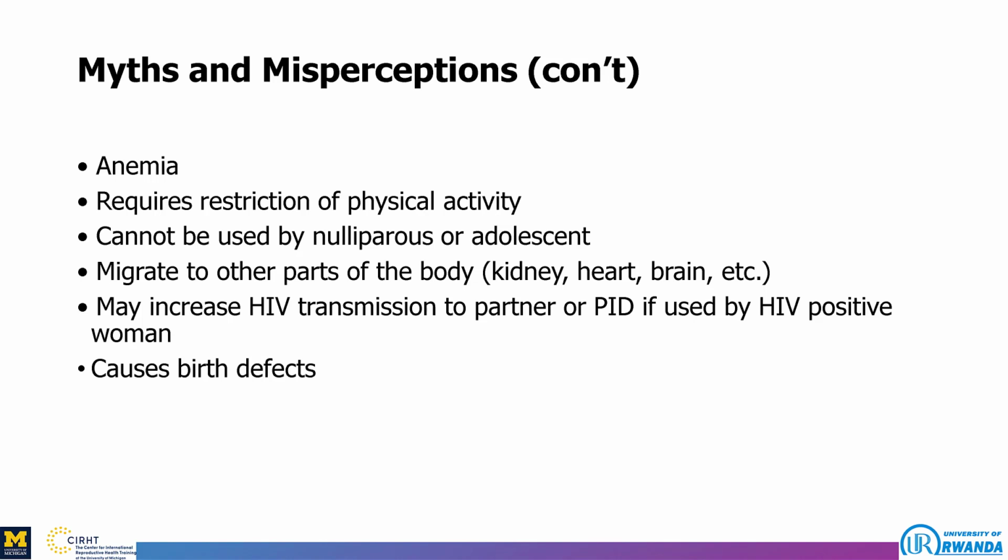May increase HIV transmission to partner or pelvic inflammatory disease if used by HIV positive women. Of course, that is not true, because if before insertion the woman is clinically well and she's taking her antiretroviral drugs properly, then there will be no problem. But if the woman has infection already, or the patient is clinically unwell, or that patient is not taking her antiretroviral drugs as prescribed, then the person will have a high incidence of getting sexually transmitted infections.